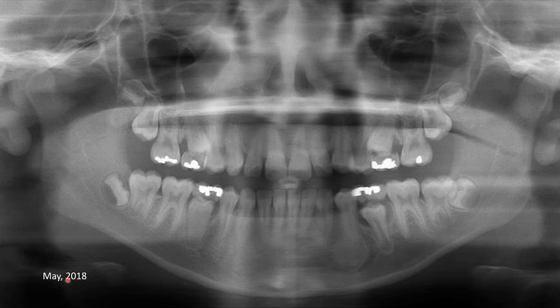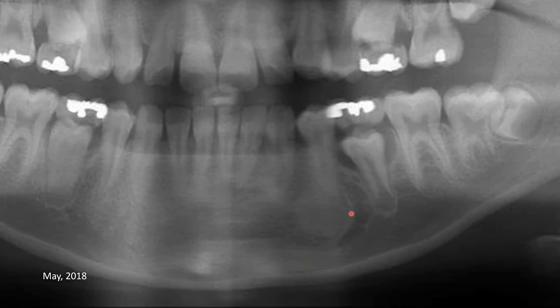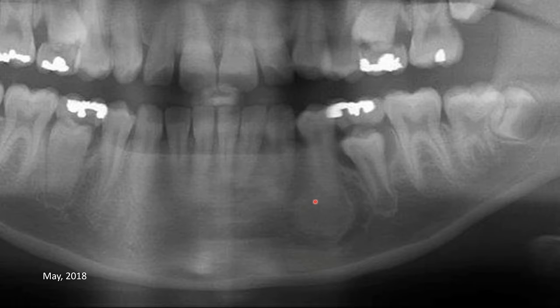We have one more radiograph taken two years after, from May 2018. Again, let's zoom to the area of the premolar. Now we can see the radiopacity forming around the apex of the premolar — it is circular, almost homogeneous, and well defined. It may have a little less density than what we saw on the 2020 radiograph.